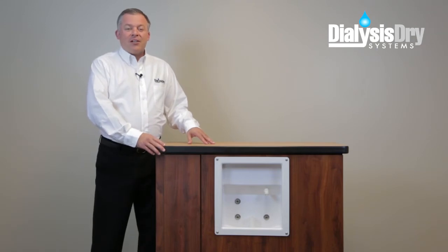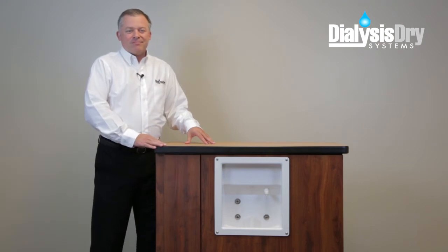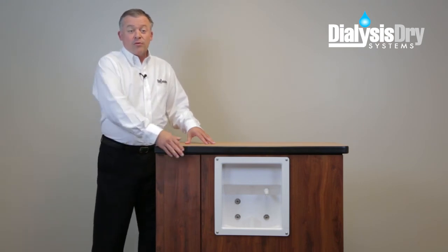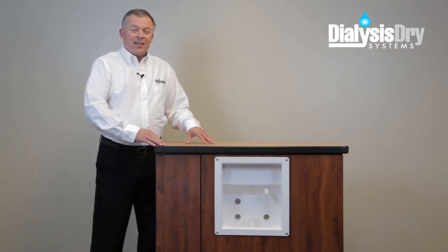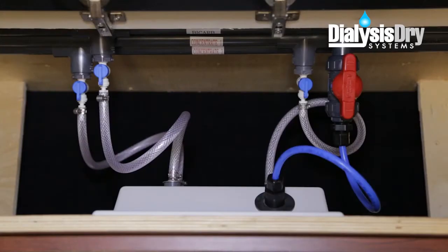Here we have a standard dialysis chase cabinet with the supply and waste box on the front and a top entry. To begin, we'll be removing the supply and waste box on the front of the cabinet. But first, open the top lid and, looking inside the cabinet, close all the valves of the tubing connected to the back side of the supply and waste box.